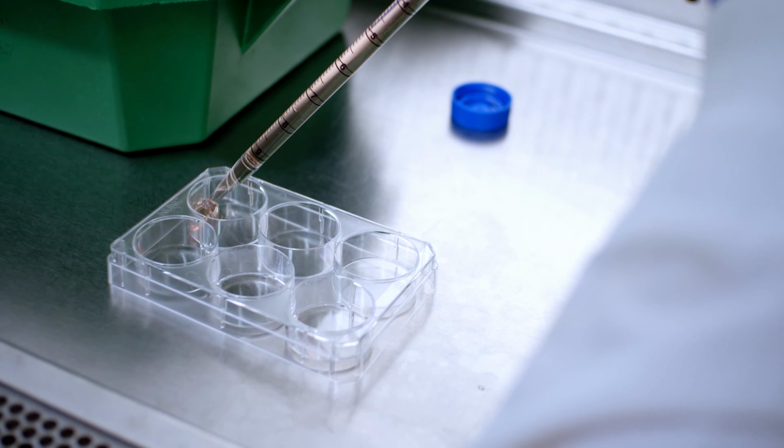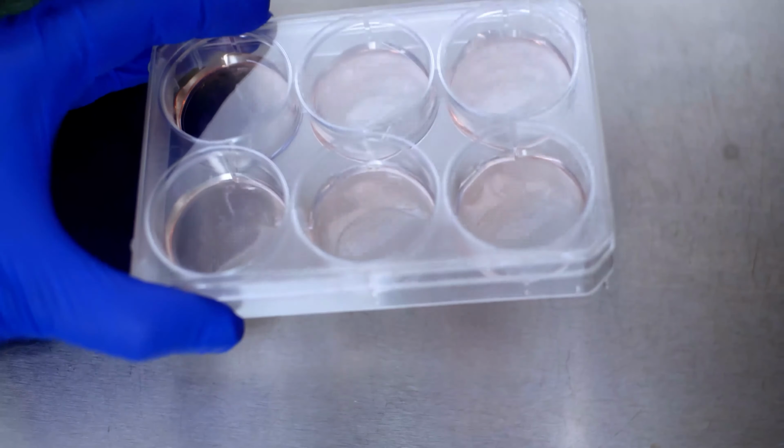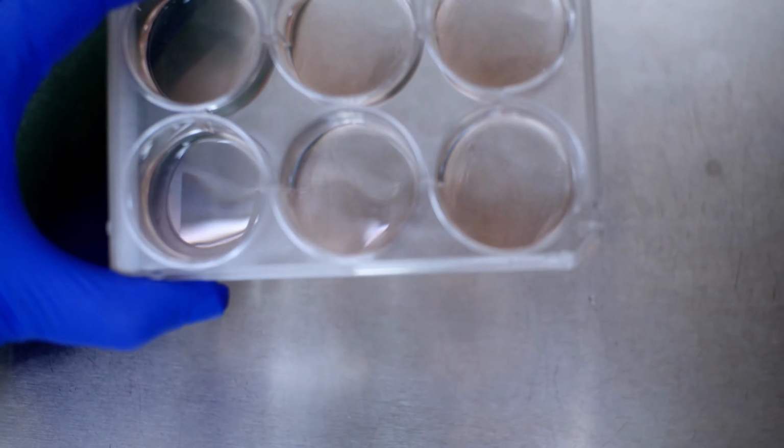Add dilute matrix to the vessel for coating. Sufficient volume should be added to cover the growth surface of the vessel. Swirl the vessel to encourage full surface coating.